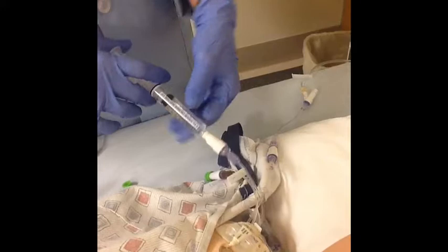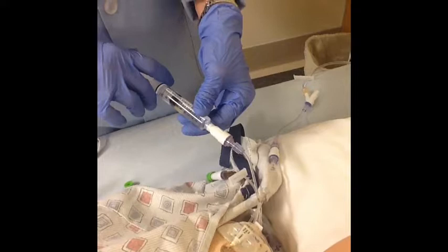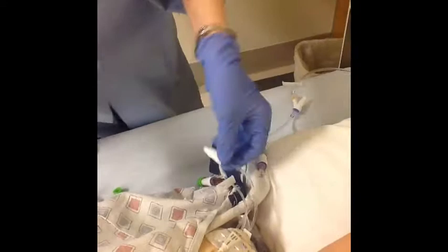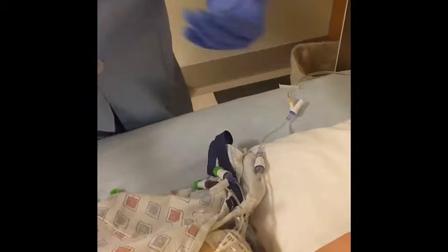We'll continue flushing at the same rate until all the drug that was in the line is cleared, then flush with the remaining saline to reach 5 to 10 cc's total. If your patient is on fluid restriction, you might only give 5 cc's; otherwise, give 10. Now I'm going to put a new curose cap on the end of this positive pressure valve, clamp it again, and we're good. Make sure the patient is okay.